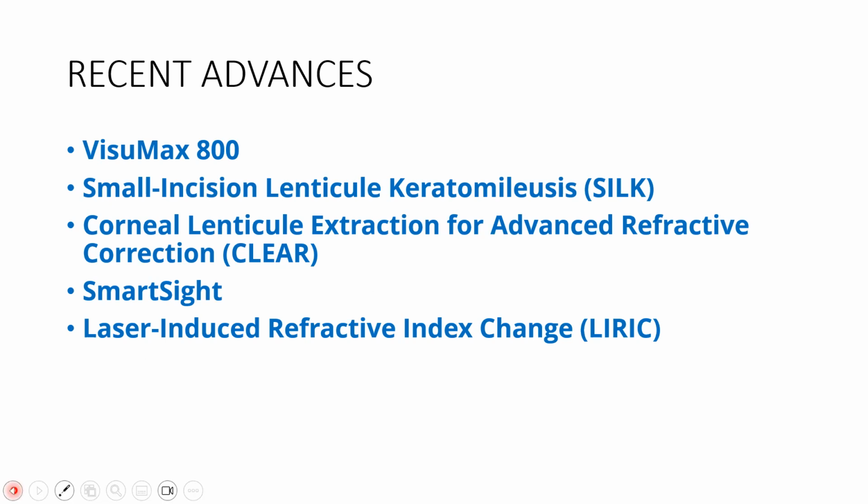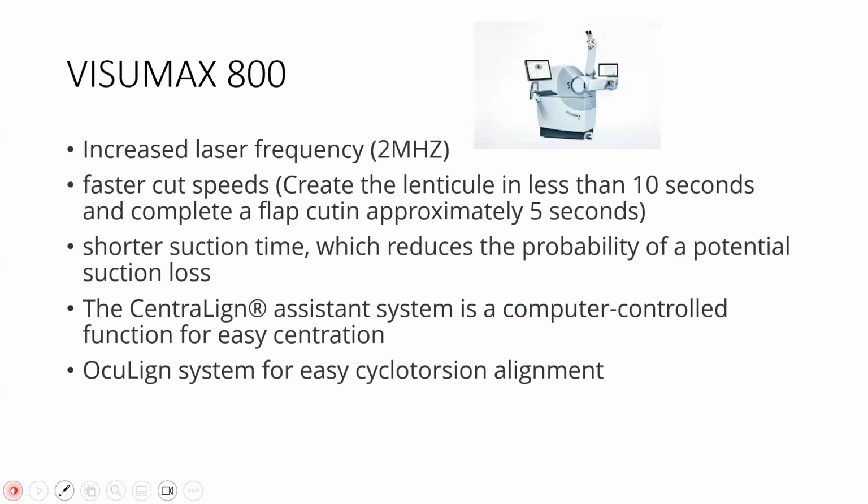Coming to recent advances, I'll try to cover this quickly, sir. I'll be discussing VisuMax 800, small incision or smooth incision lenticule keratomileusis, which is known as SILK, corneal lenticule extraction for advanced refractive correction, which is CLEAR, SmartSight, or laser induced refractive index change.